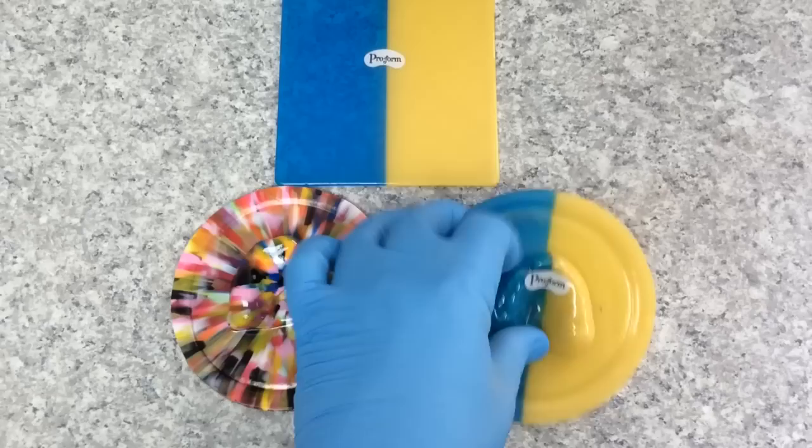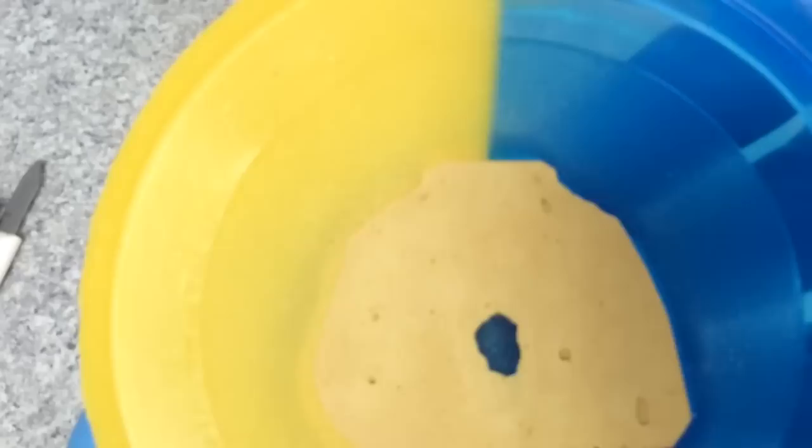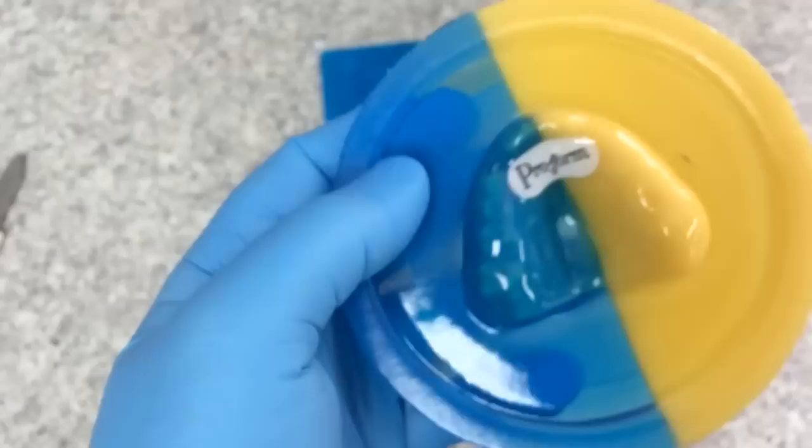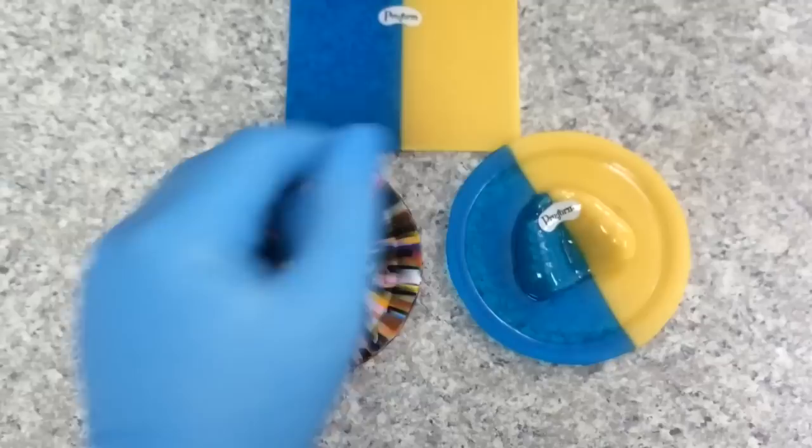If I flip this over, you'd see that it is formed right along the edges of that. There's no gap at all. This is what gives a custom fit mouth guard such a better fit than the boil and bite mouth guards that you'd get from the store.